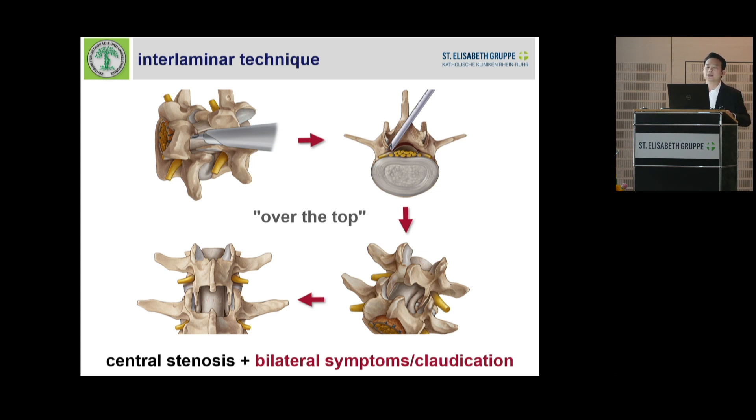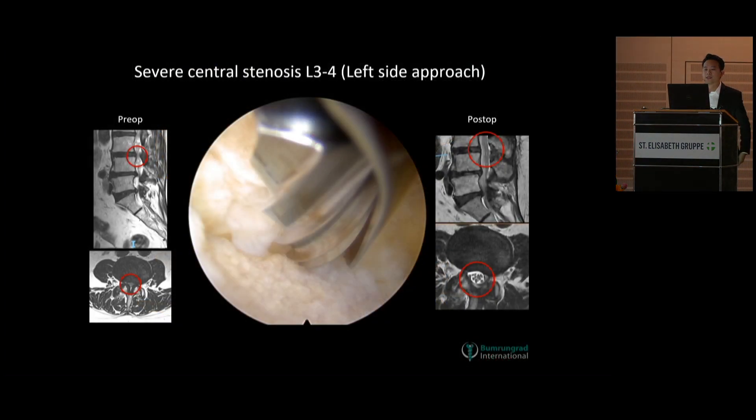And most of the time we just cut the flavum so we can decompress the thecal sac. This case is about a 70-year-old woman who presents with claudications on the bilateral side. I approach from the left side — this is L3-4.